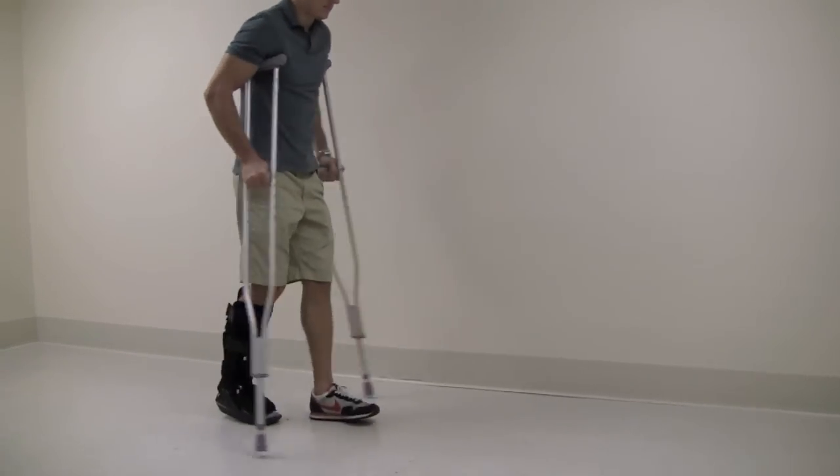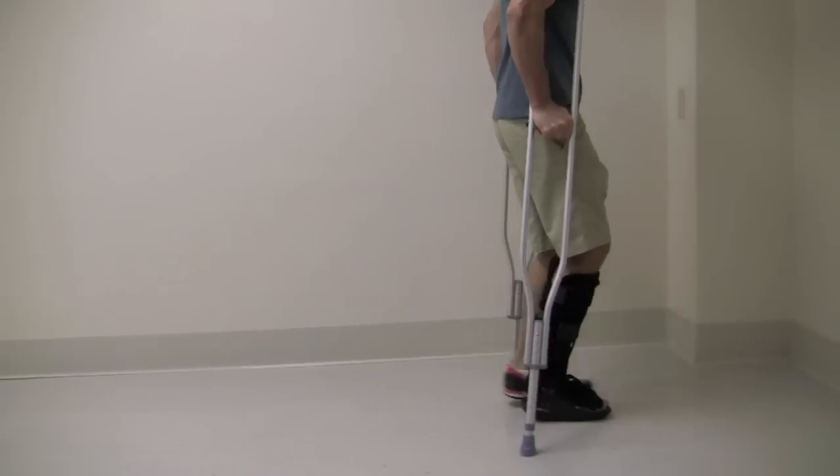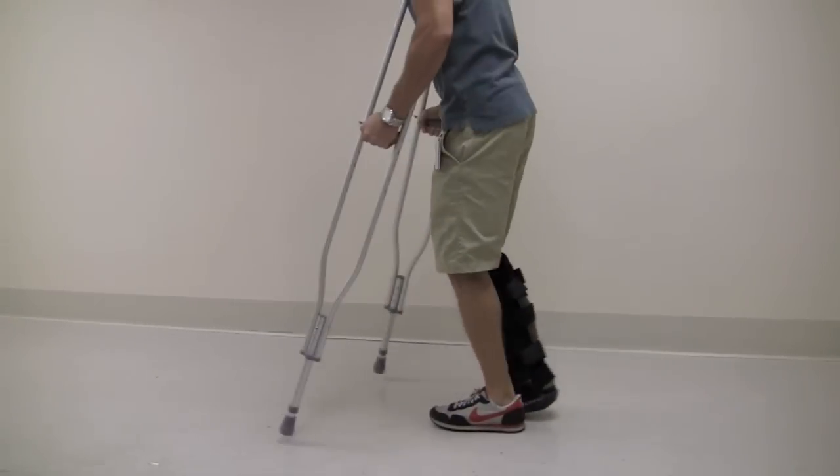Here a portion of the patient's body weight is placed on the foot with the use of crutches. Partial weight bearing can also be accomplished with the use of a walker.